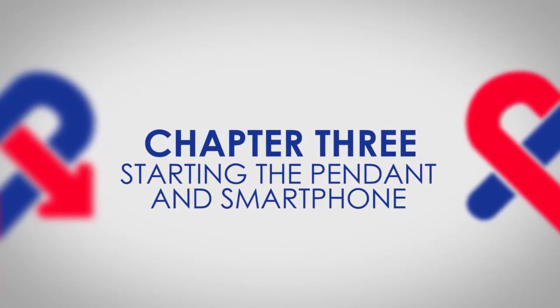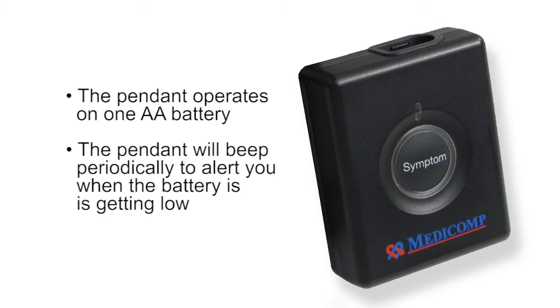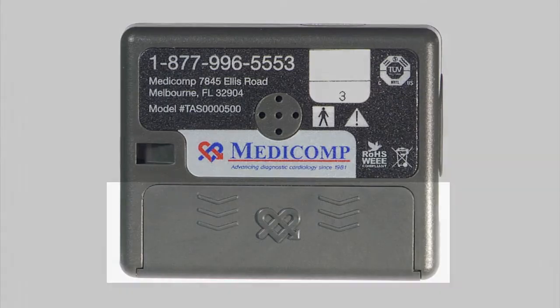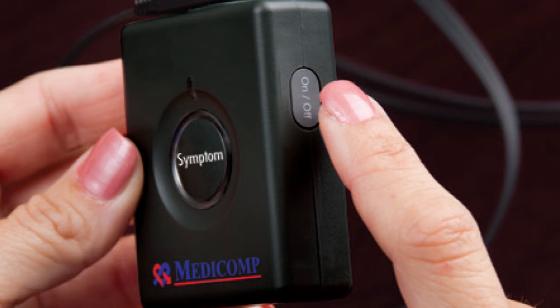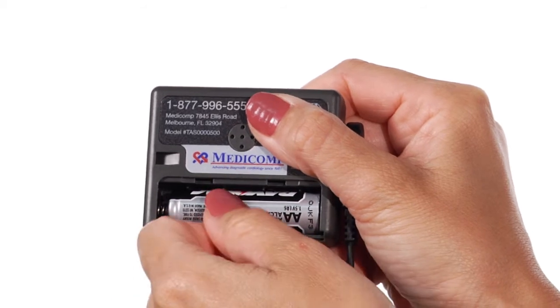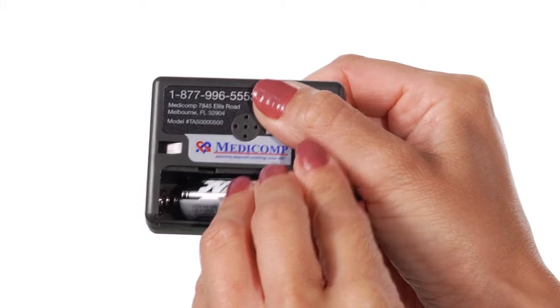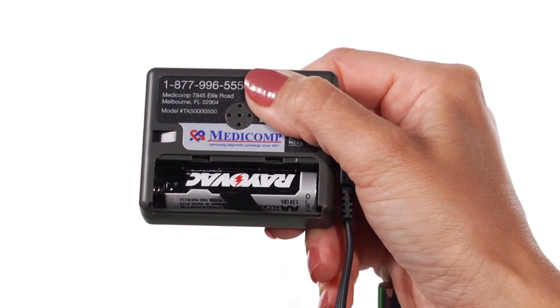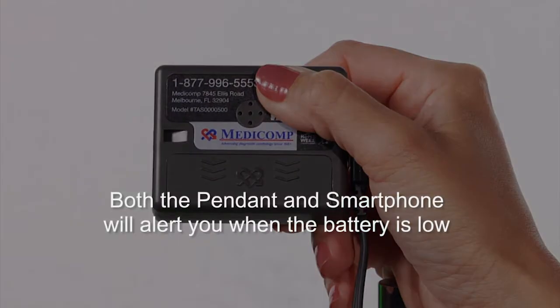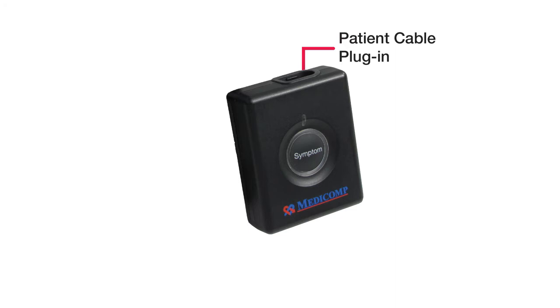Starting the pendant and smartphone. The pendant operates on one AA alkaline battery and will beep periodically to alert you when the battery is getting low. To install a new battery, first turn off the pendant by pressing the on-off button on its side — it's important to power off the pendant before changing the battery. Slide the battery door in the direction of the embossed arrow to remove it, then remove the AA battery. Insert a new battery using the embossed picture inside the compartment as your guide. Align the cover and slide the door back into position. To turn on the pendant, press and hold the on-off button until you see the device lights blink and hear a three-tone chirp, indicating the unit has successfully turned on. Plug the patient cable into the top of the pendant if not already plugged in.